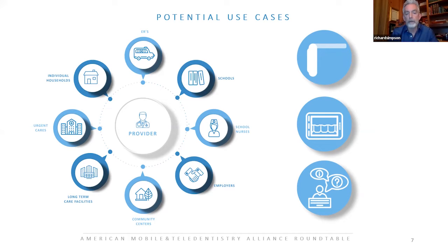Being able to have dental offices, say a general dentist in a rural community, be able to cover 2 or 3 counties by expanding her workforce, sending hygienists out or coordinating with independent hygienists and rural care facilities, rural hospitals being an on-call service, it really opens up opportunities to be able to take imaging and assess those.